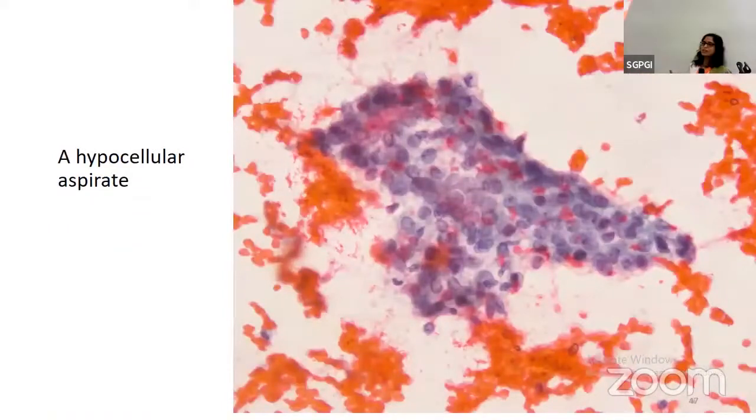So this aspirate depends upon the type. I didn't call it Hashimoto. This aspirate depends upon the site of aspiration, that particular focus. That's what I'm saying. So I call it AUS. I cannot call it thyroiditis. This is a cytological pitfall. That's all.